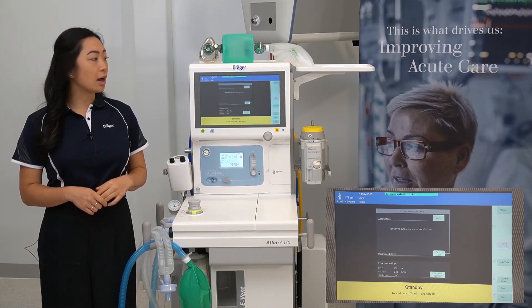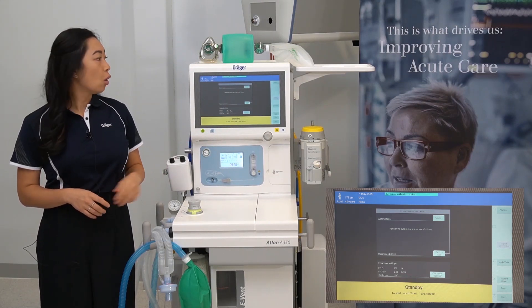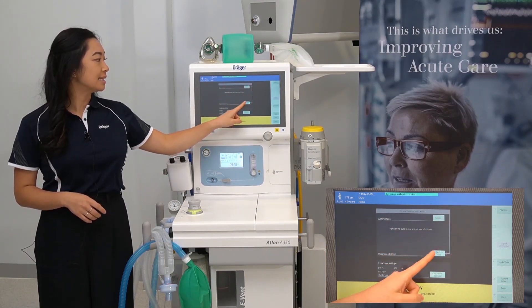To start one, you can either select it from the test menu on the right-hand side of the screen or follow the grey arrow to system test.